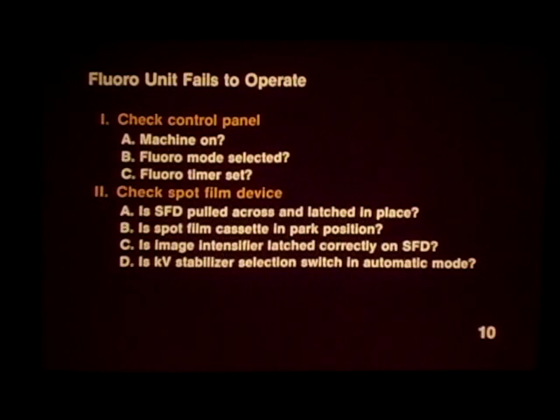The last step is to see if the foot switch is plugged in or if there are any wires exposed in the foot switch. This checklist may vary slightly and will be determined by the make, model, and operational characteristics of the radiographic equipment being used. If the radiographer tries each solution and the fluoro still will not operate, then the radiographer in charge should be notified of the need for a service call. In other words, the radiographer has done everything he or she can.